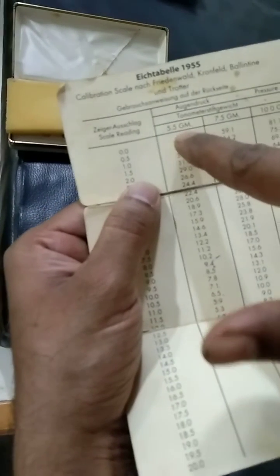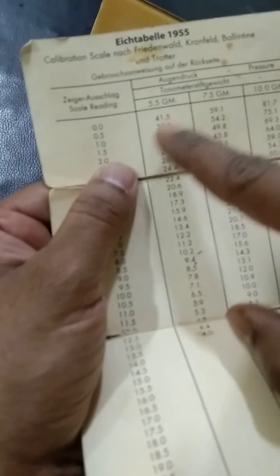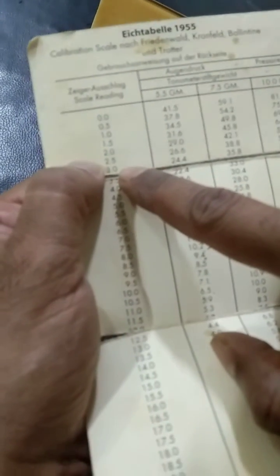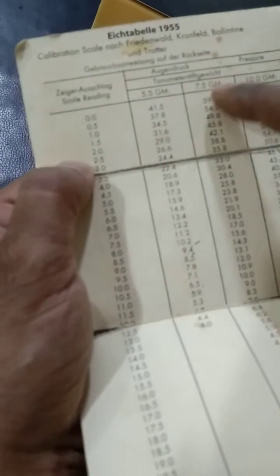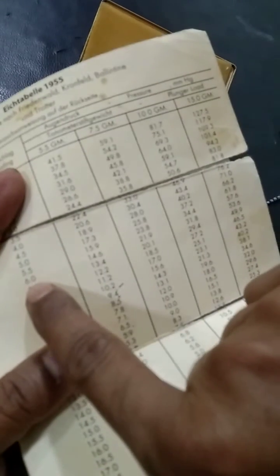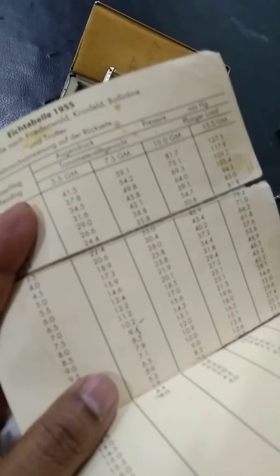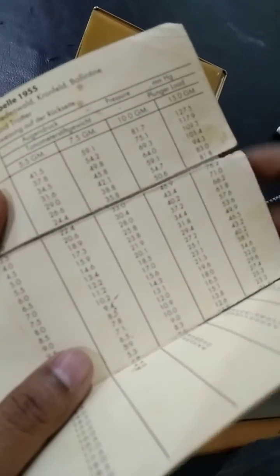So with the first 5.5 gram weight, it was showing 0, which means the value is 41.5. Whenever the value is less than 3, we are supposed to check with a different weight — which is 7.5 or 10 grams. I have checked now with 10 grams and the reading was 6, so we read the value as 31.8. The final value of the patient's intraocular pressure is 31.8 mm of mercury.